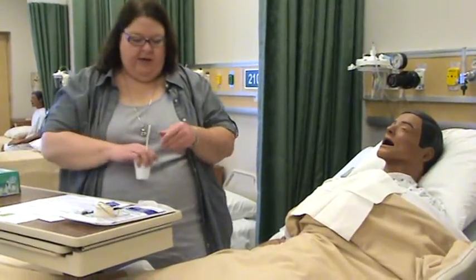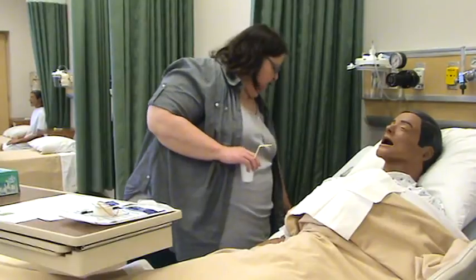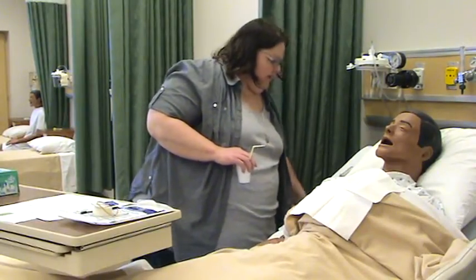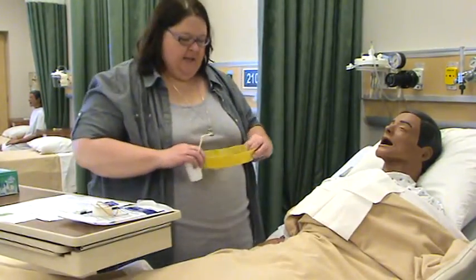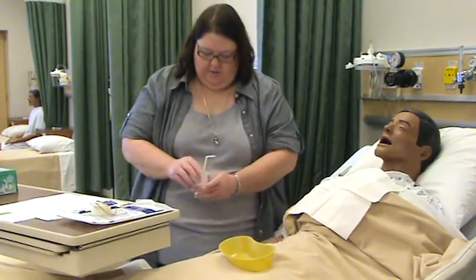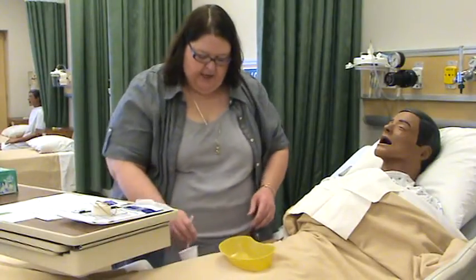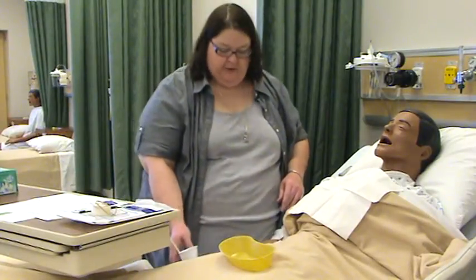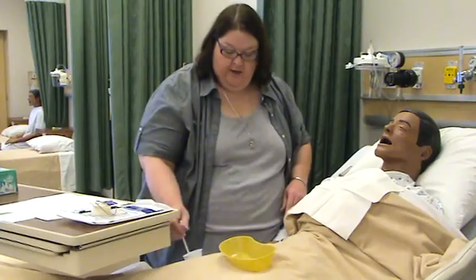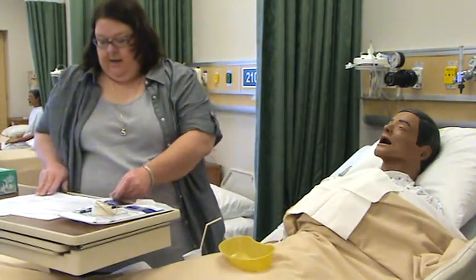I've got some water in a cup here for you, and I also have an emesis basin so if you need to throw up you've got that. I'm going to put this cup with some water in your hand. When I tell you, you're going to take a few sips of water — that'll help it go in the right place.